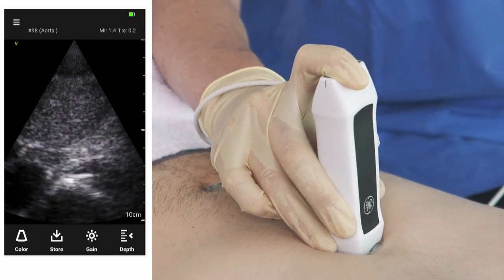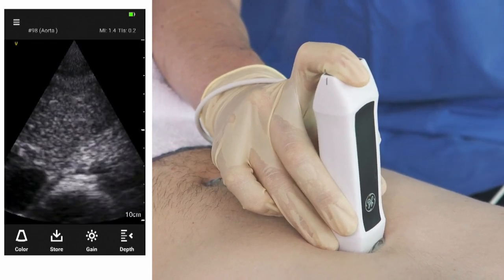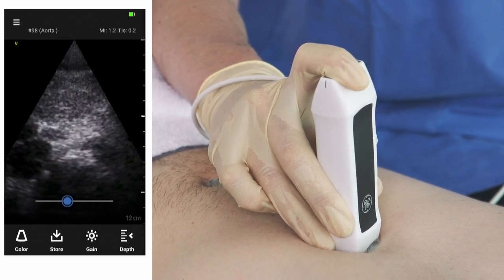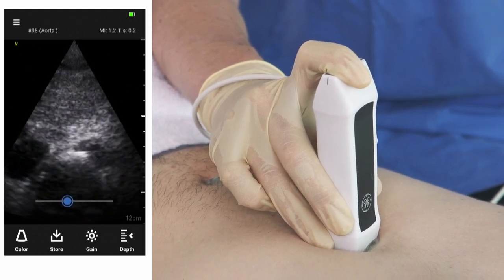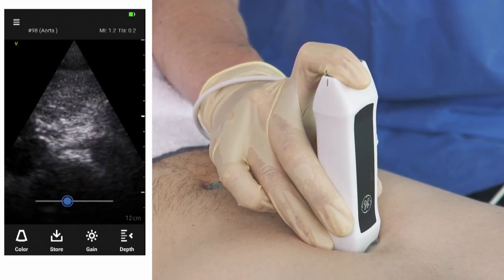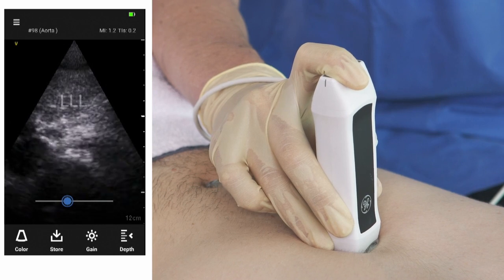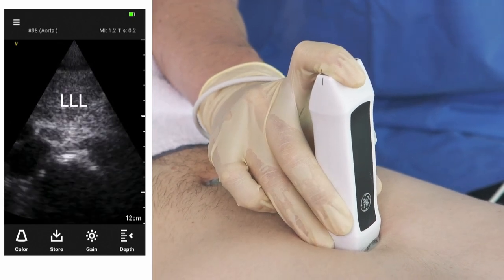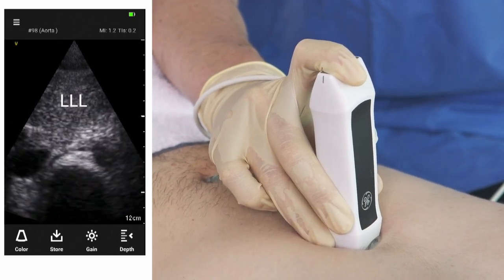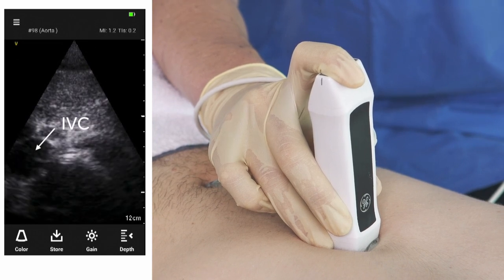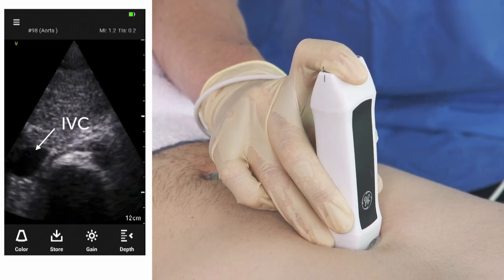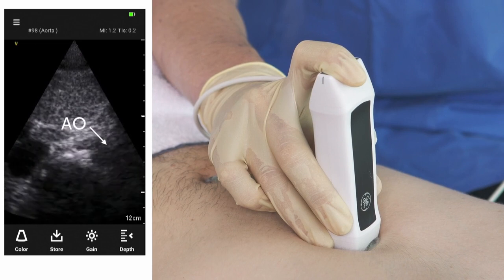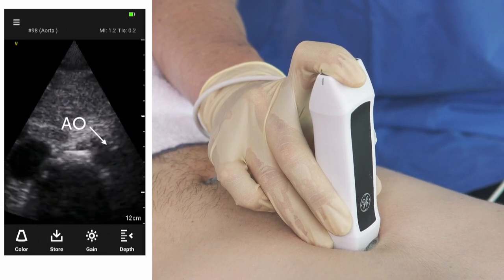Let's take a look at our imaging screen. Adding a little more depth in this case, the first landmarks you can appreciate are the left liver lobe. On the left-hand side of the screen you can see the IVC, and on the right-hand side the black structure is the abdominal aorta.